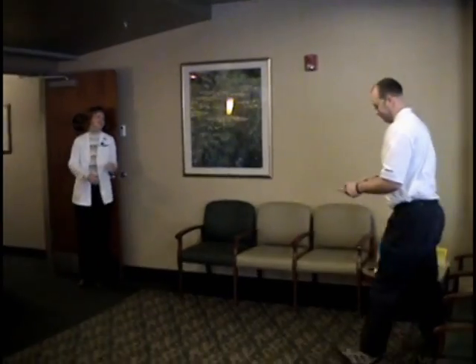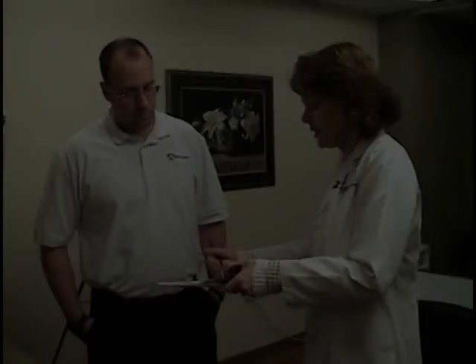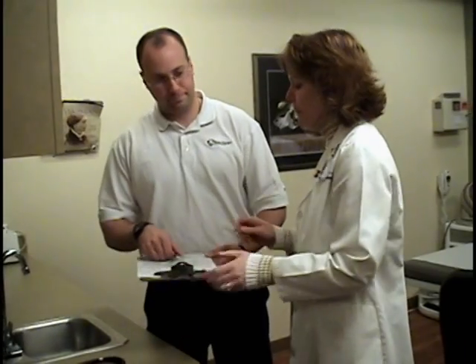When a room becomes available, our sonographer will greet you and guide you to where the test would take place. She will then review the stress echo consent form with you and you will be given an opportunity to change.